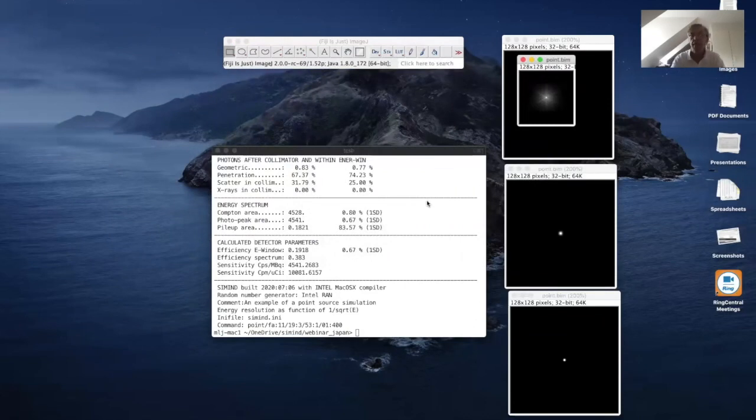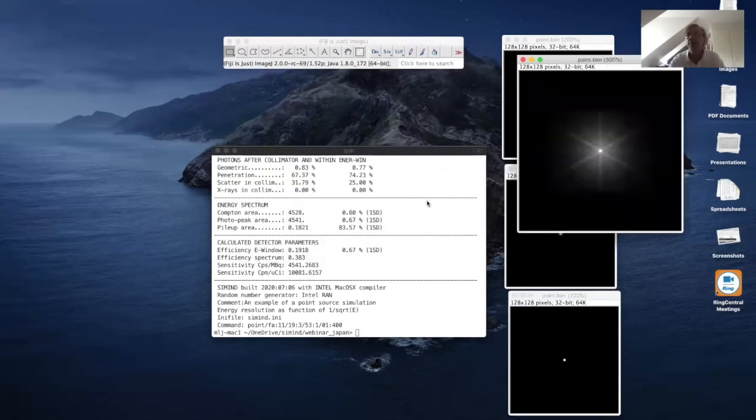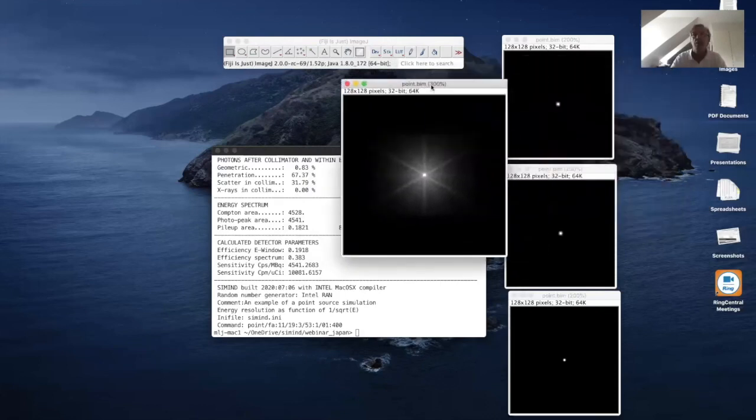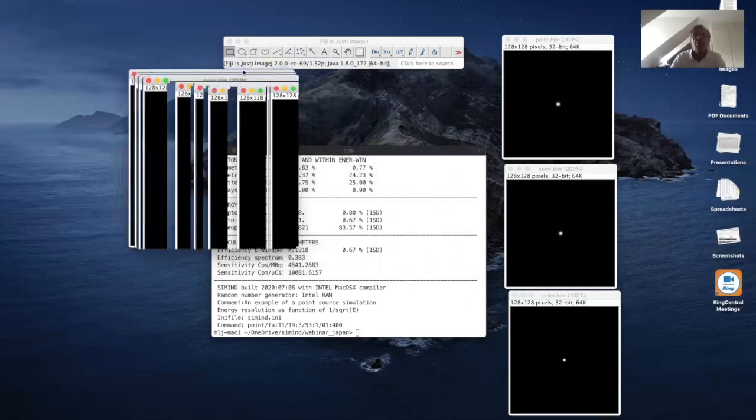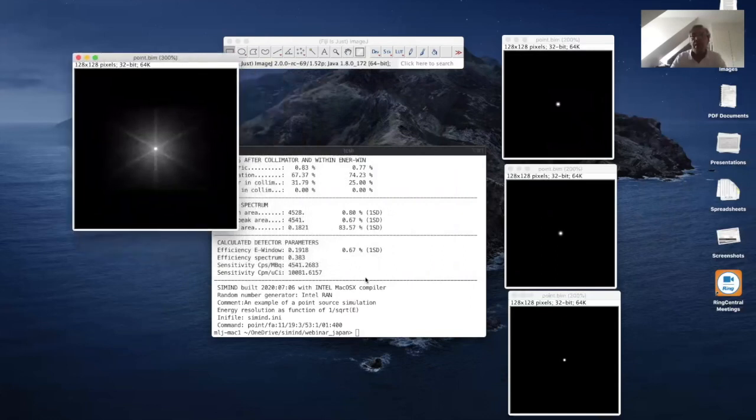So now you can see that we have penetration effects here, and with these well-recognized stars, 6 lines, because we use a hexagonal hole. I've also shown now how you can make problems for yourself if you don't open up too much of your acceptance angle. So let us now say that we use not number 3, but a value of -30.